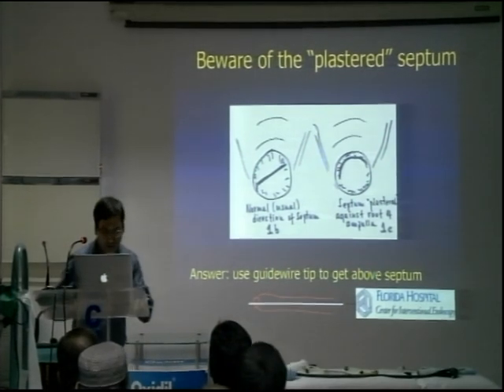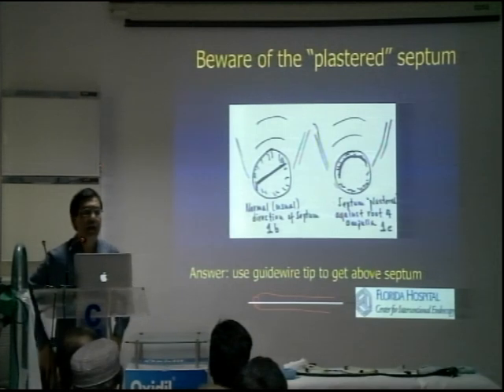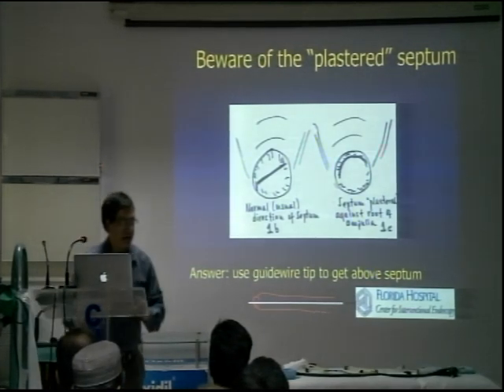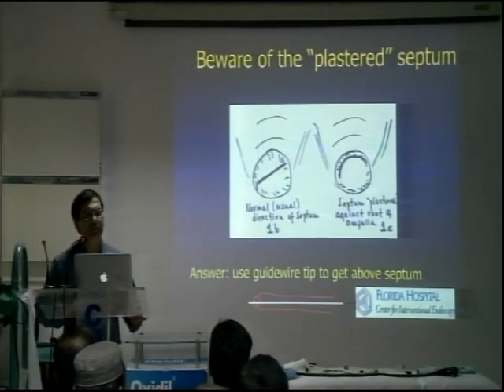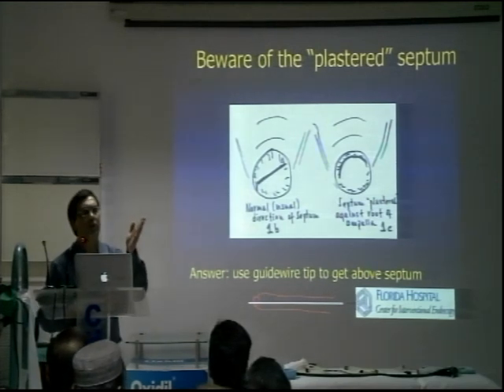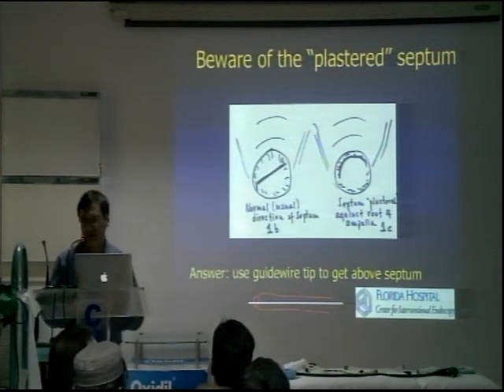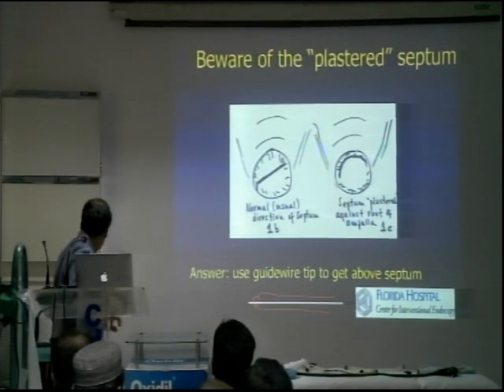And another thing, yesterday I was talking about this septum. We talked about that. Sometimes you are cannulating and you keep getting into the PD in spite of being in the right place. You are maneuvering your sphincterotome tip up, you think you are in the right place, but it just keeps going into the PD.